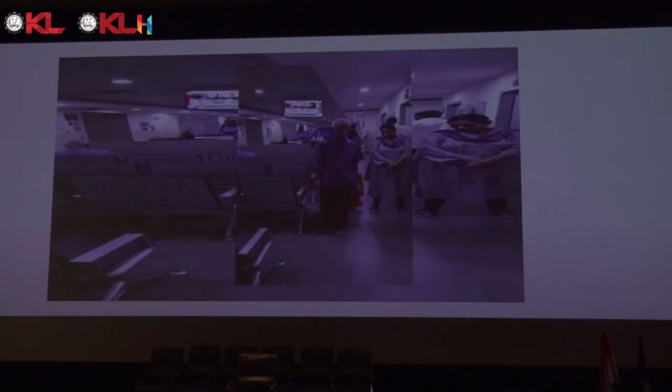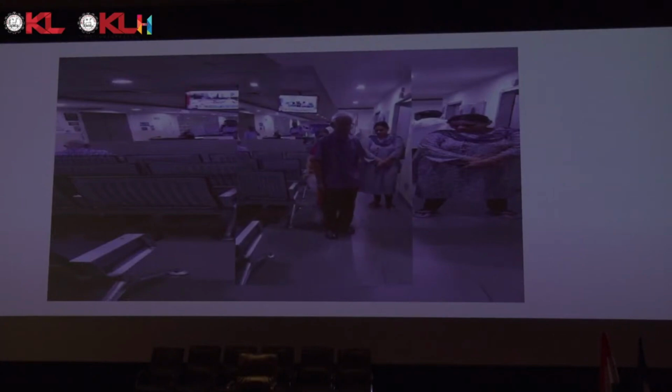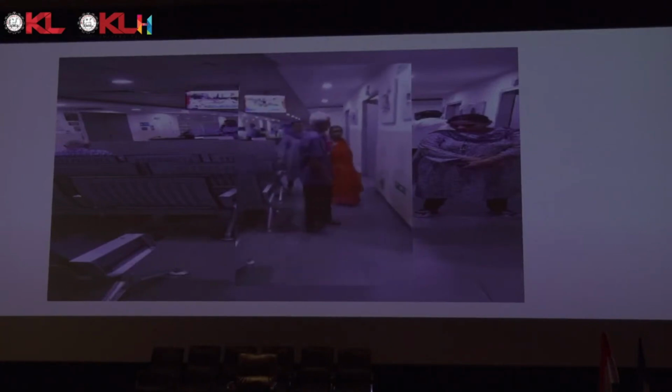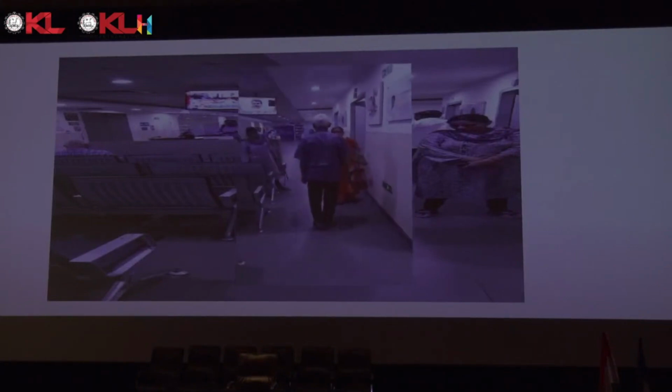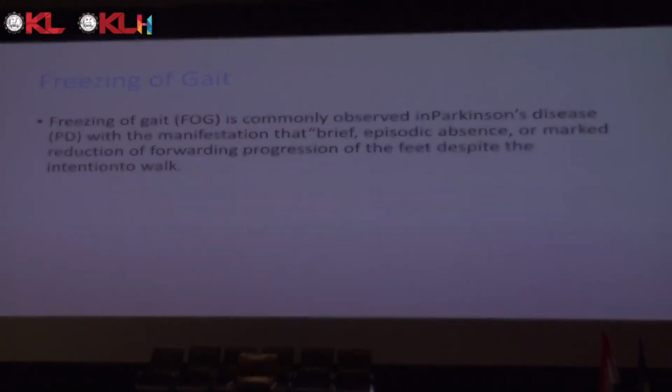In this patient, we did DBS one year ago. Still, he is having significant freezing of gait. We have changed all the parameters. We did not use any directional lead in this case. In the initial three to four months he was well. After that, he still had significant issues. The freezing of gait is not controlled presently with DBS, or even with medication. Freezing of gait is commonly observed, in on-off or off FOG also.